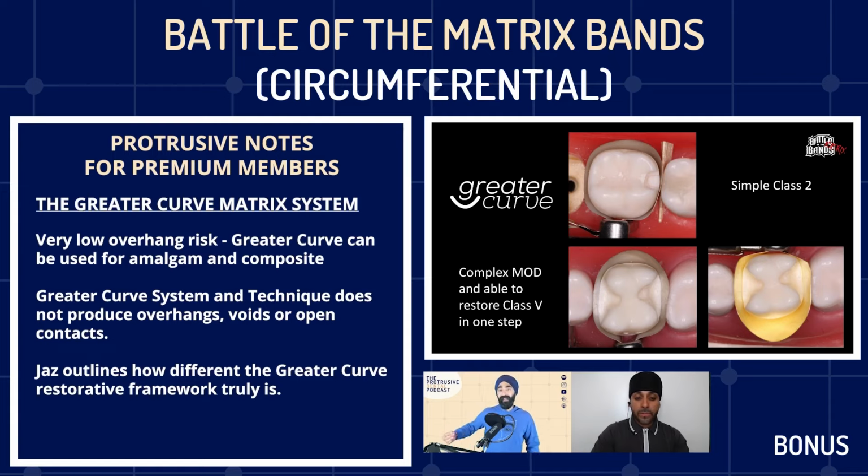And then the other thing that we're going to touch on is, what the hell? I can't believe you do this. The burnishing technique is where you get a burr, and I saw this on YouTube, you drill away the metal matrix until you see the adjacent tooth, and then that's how you restore. I know you say there's an alternative way of super burnishing, which you didn't come to, but for me, as someone new to using the system, that was like, whoa, this is super different.